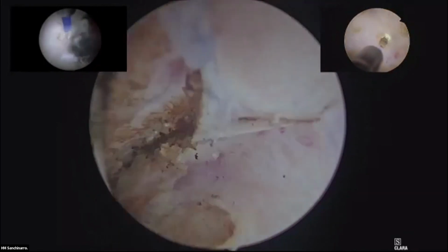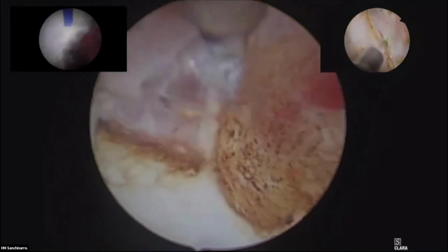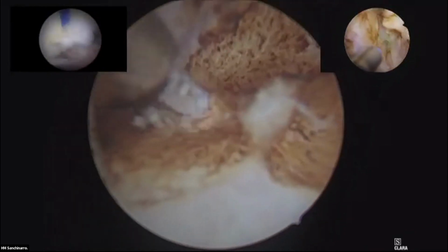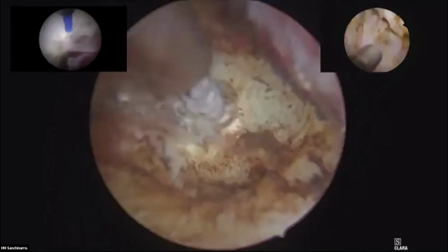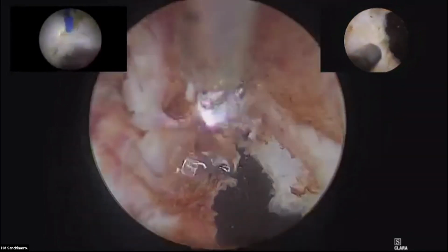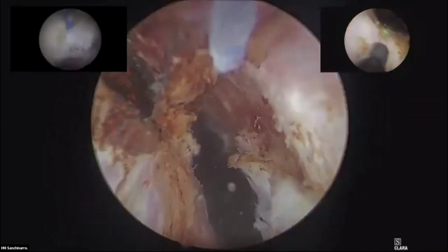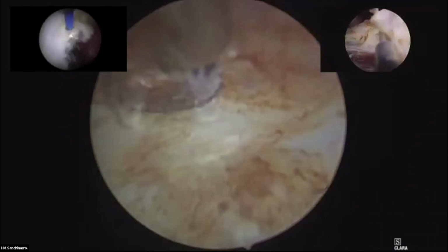You need an energy to do a correct enucleation. You choose, and I think that thulium is the one that forgives a lot of mistakes, but you can easily start with holmium and then shift to thulium. So it's not a problem.